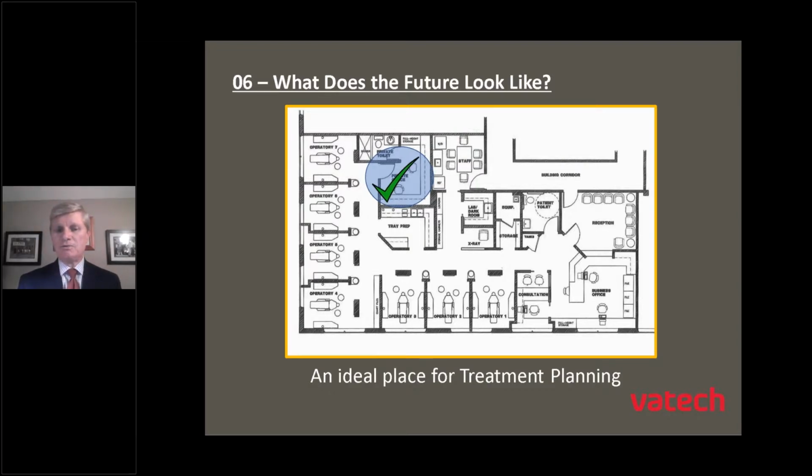The feedback I get almost universally from doctors that I train who have just incorporated 3D in their office is they really feel apprehensive talking in front of a patient and navigating the software, for fear that by maybe not moving the software correctly or making a mistake, you could lose confidence in your patient. Well, if you're losing confidence in your patient, there's a good likelihood you're not going to get the type of case acceptance that you're looking for.